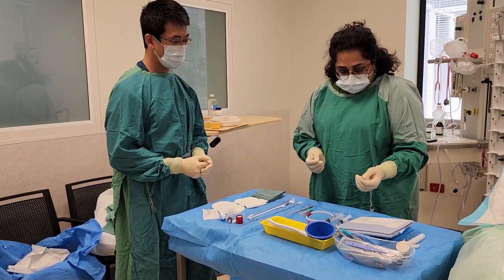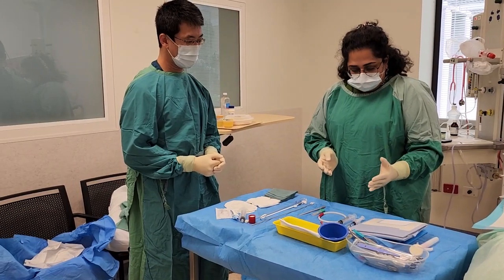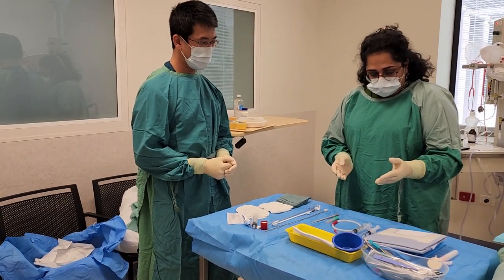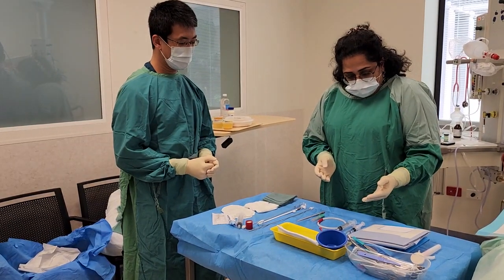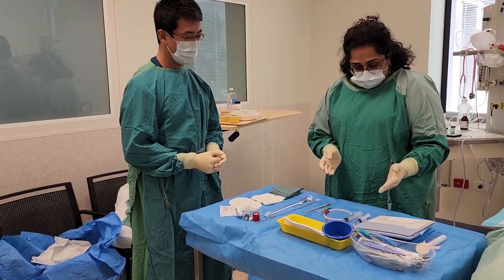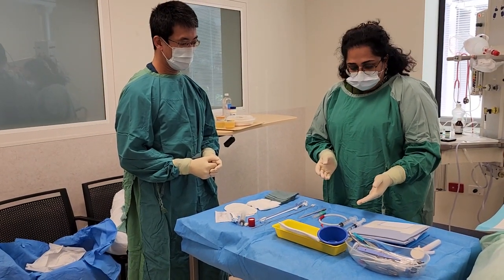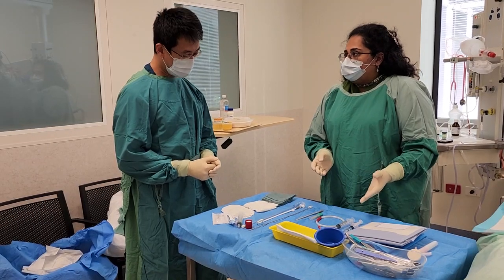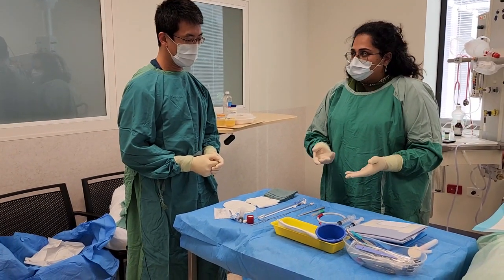And after I put the lidocaine in and get the skin nice and numb, we will use the introducer needle, which is an 18 gauge needle, to enter the pleural space. We have a syringe attached to that to verify that we are indeed in the correct space and we have aspiration of fluid.